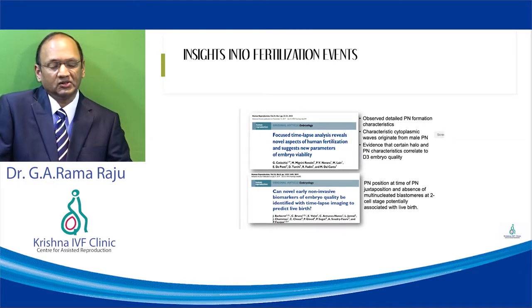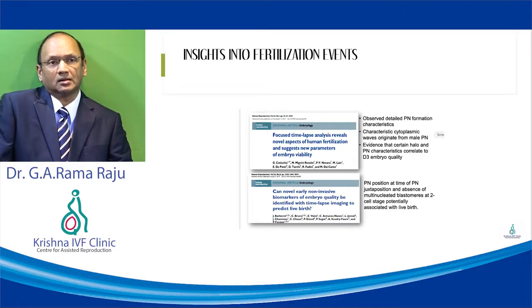There is another paper which says a possible biomarker, non-invasive time-lapse technology might be in future a possible biomarker to identify embryo to predict live births.